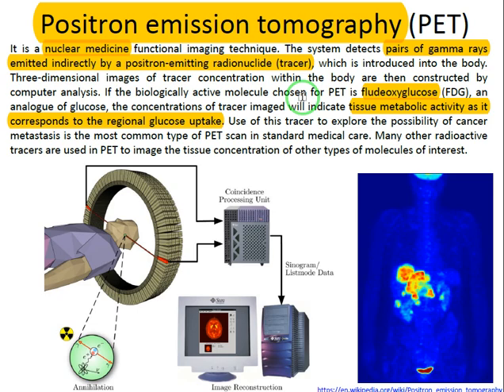And that was the reason that we mentioned magnetic nanoparticles are not the tracers, they are the contrast agents.